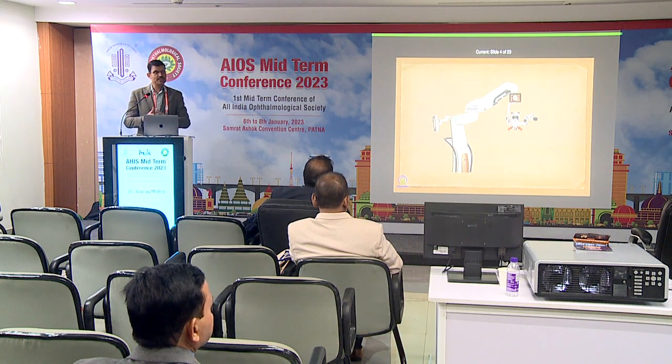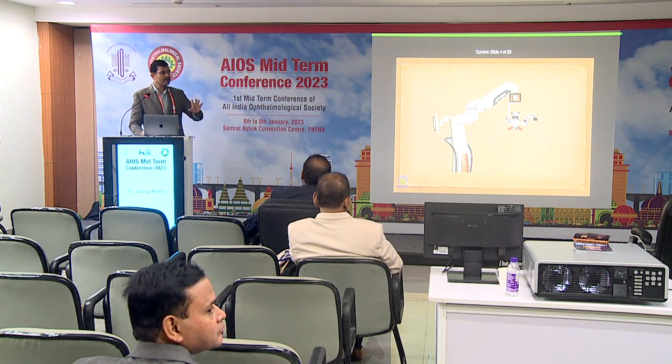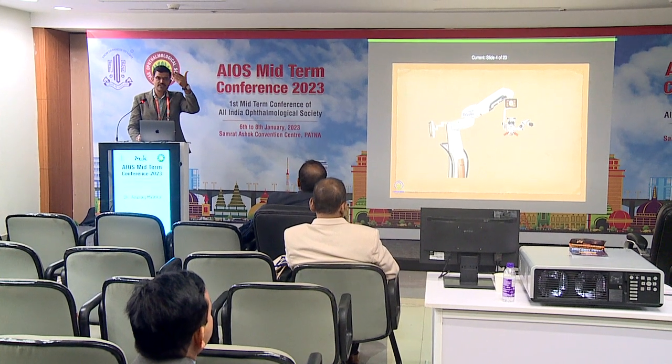Now coming to the machine proper. This is the handsomely looking dual tone Luxor Revalia for you. It has two screens. One major screen which is at the hind end of the microscope body, and then one minor screen which sits right on top of the surgeon.